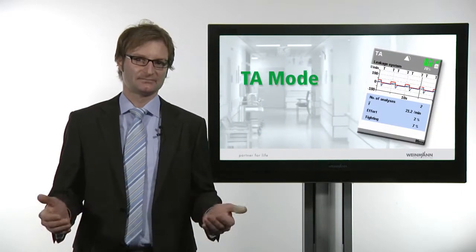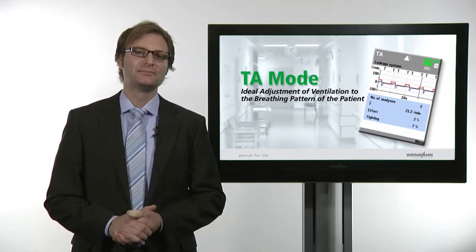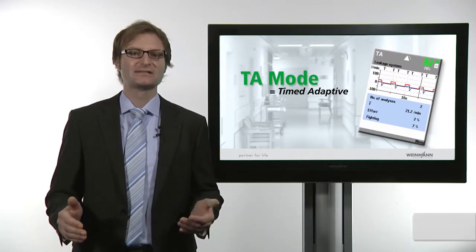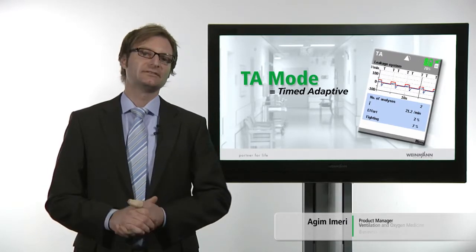Hello. Today I would like to introduce you to TA mode. What does TA stand for? TA is short for timed adaptive. It's a ventilation mode that analyzes the patient's spontaneous breathing pattern and simulates that pattern in controlled ventilation.